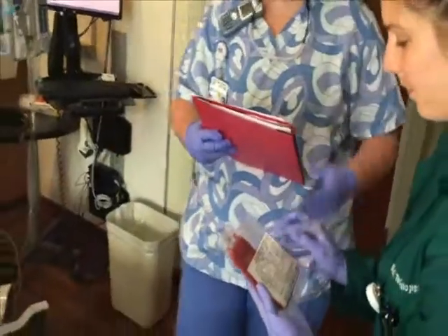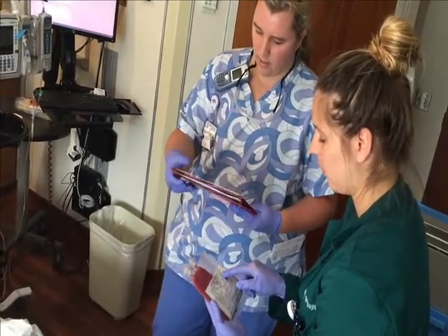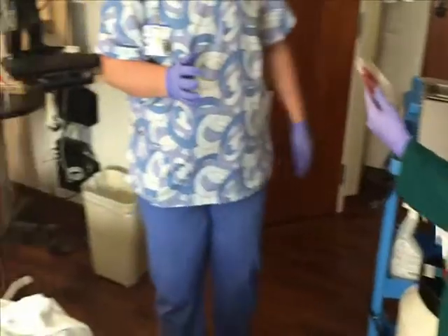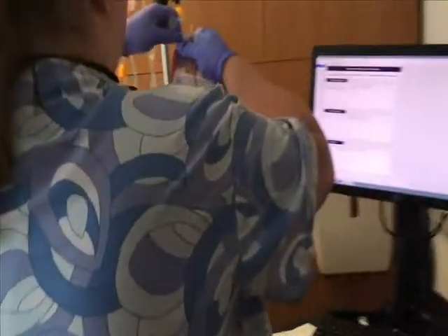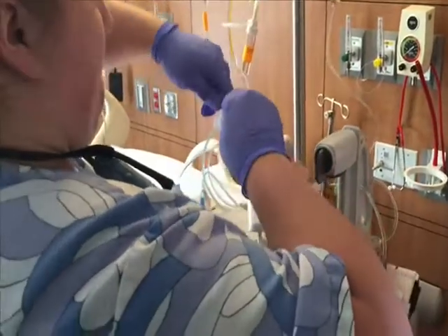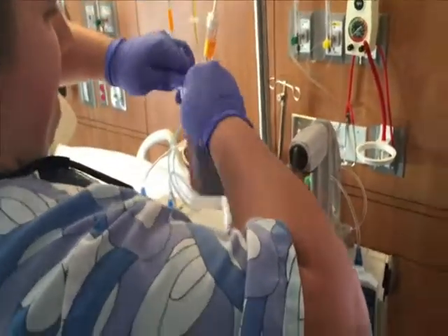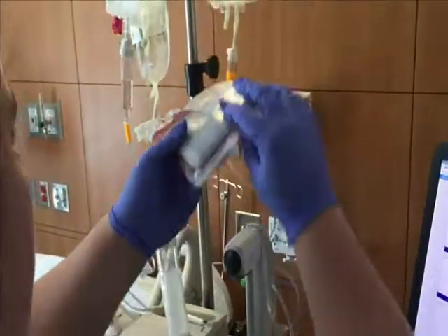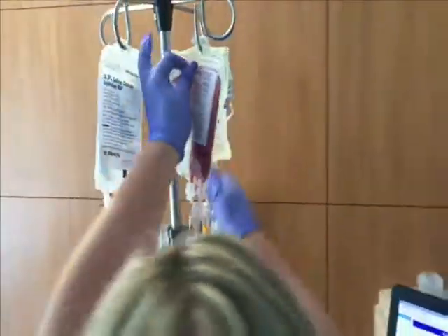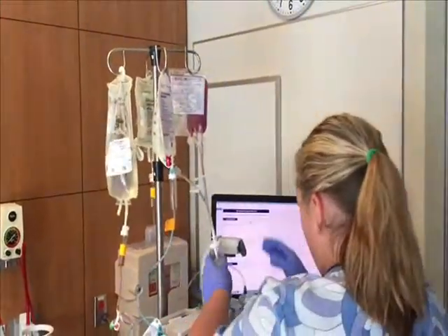All right, I have Cynthia's MRN 700-898-647, donor pool 17598, bag 1 of 3. Patient is B positive, donor is B positive. Perfect. Is there anything else I need to say? Okay. Cool. Is my name on it? It sure is. Okay. Beautiful.